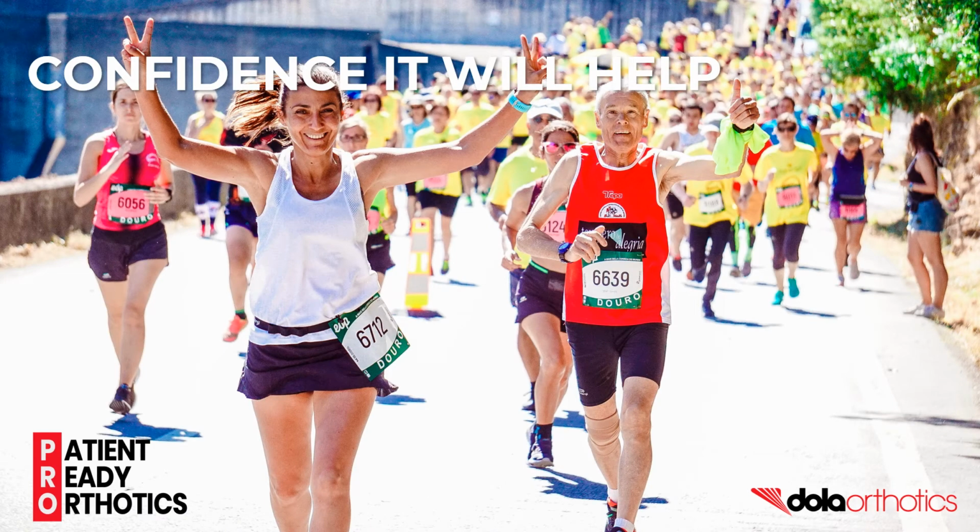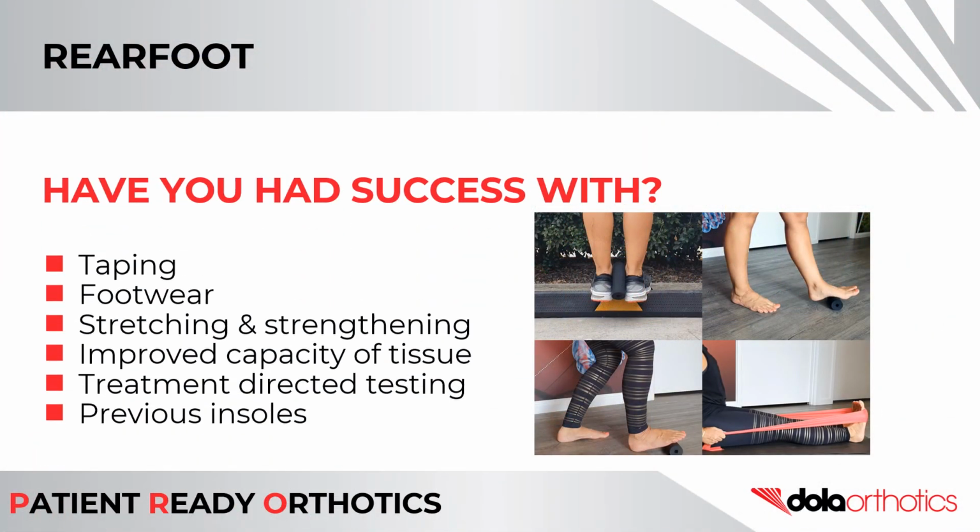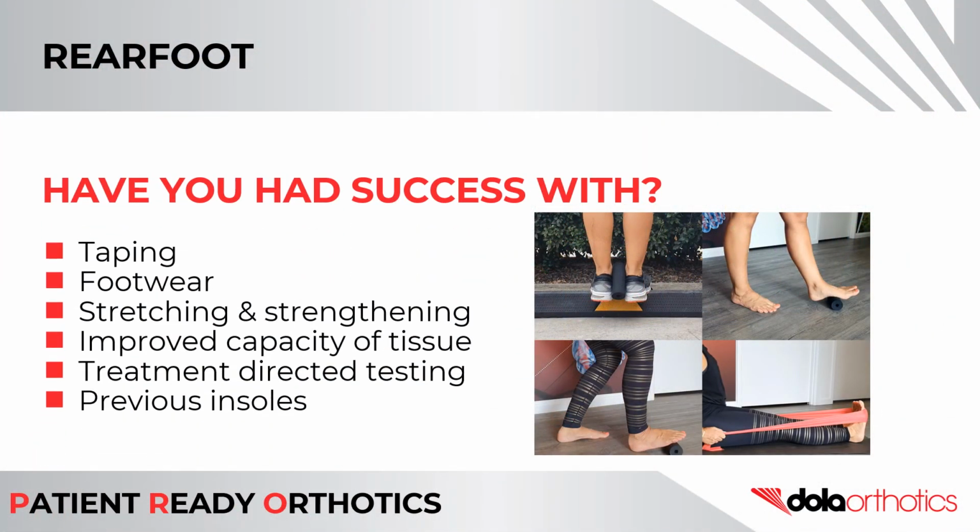The signs may already be there in your current treatments, giving you confidence that the Rearfoot orthotic will help your patients. Have you had success with Achilles taping, a footwear change to a style with a larger drop, stretching or strengthening program, improved capacity of the pathological tissue, or treatment-directed testing of a heel raise, or has your patient had previous insoles? All of these may indicate that the patient-ready Rearfoot orthotic will be a successful option.